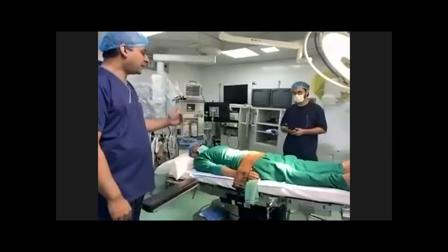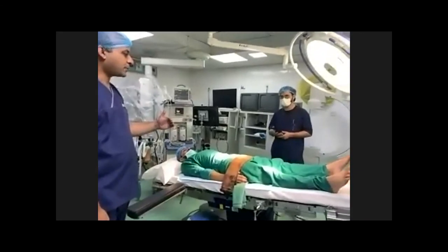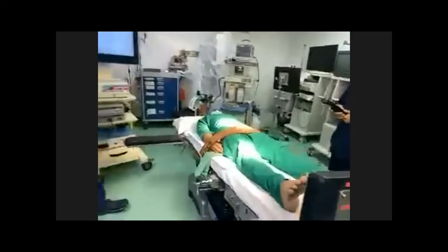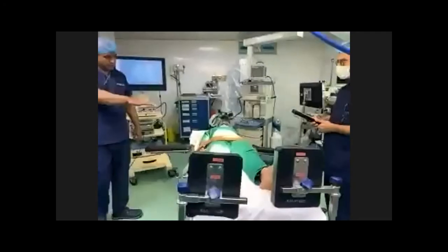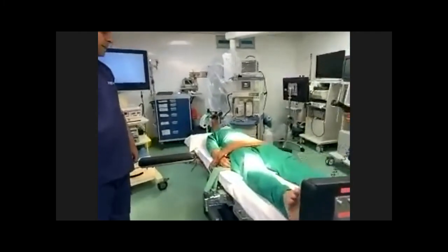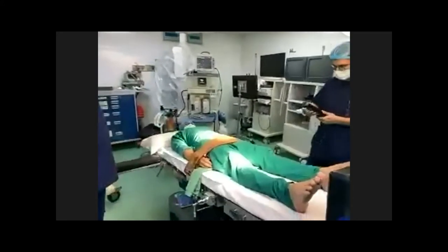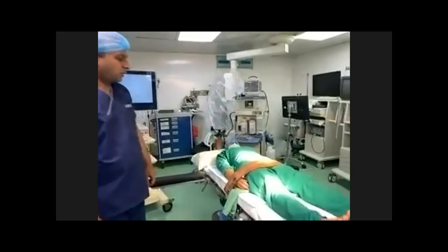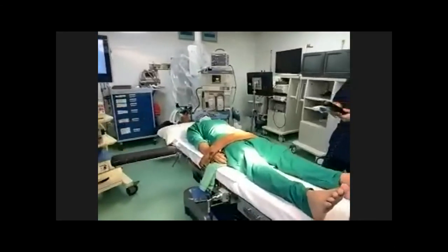If we want to do a laparoscopic appendectomy, we give a right up as well. Right up, please. This is right up. Okay, that's it. Now straighten the patient. Lock the bed. We are flattening the table.